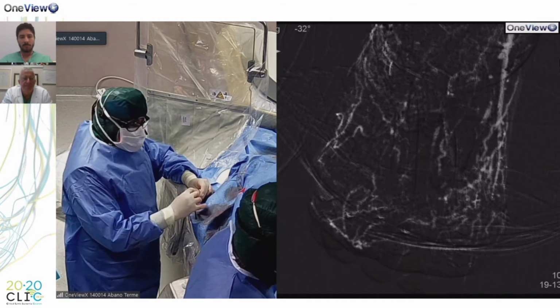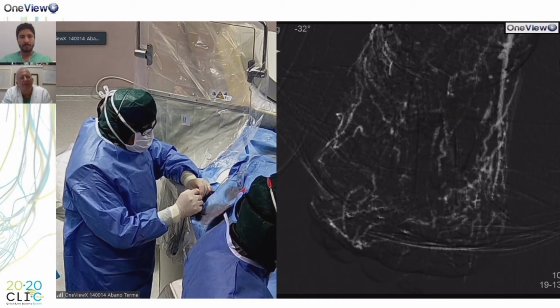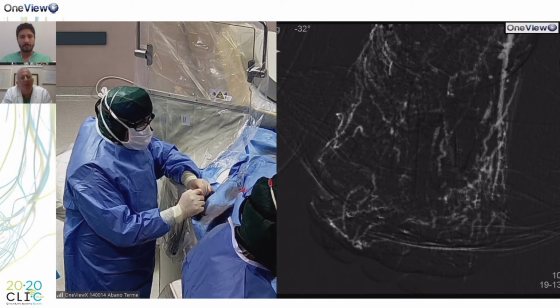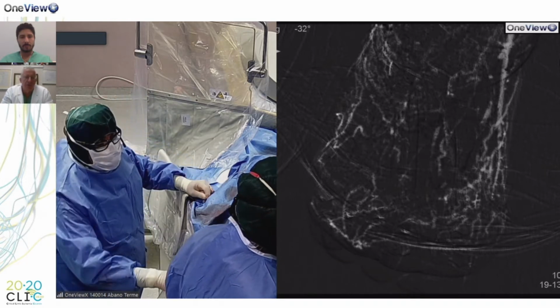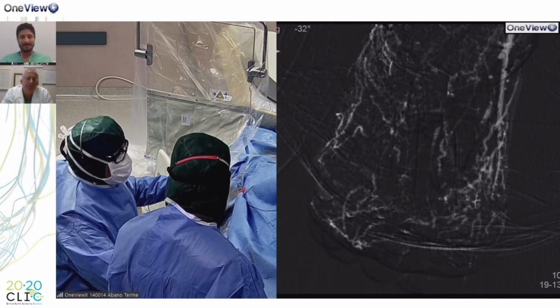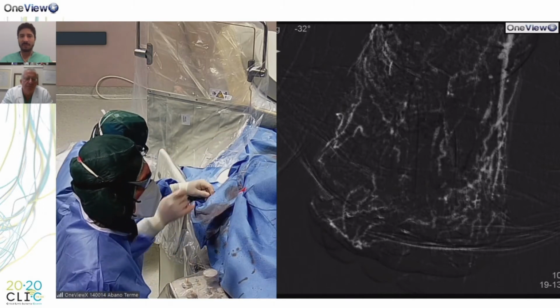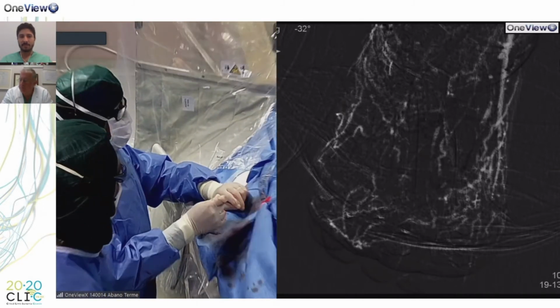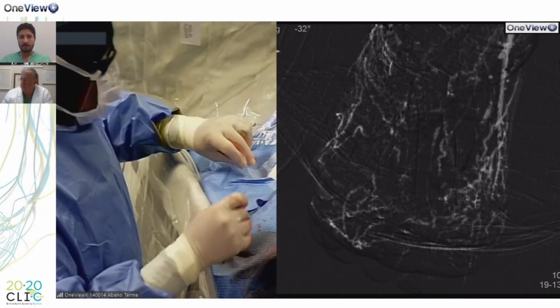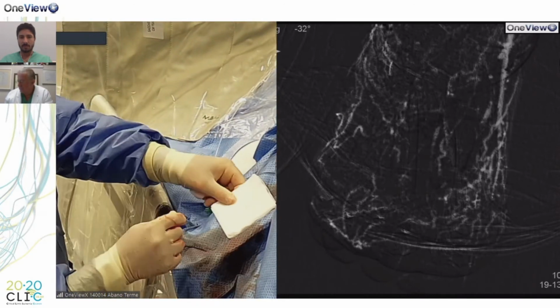In this case, we are going to... Guys, can you give me the wire? Can I show it to you? Yes, please. I'm going to show you the wire.